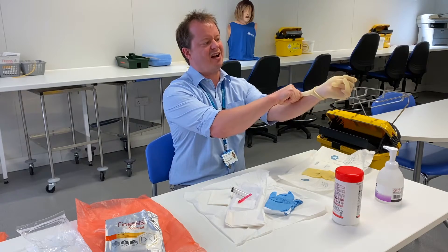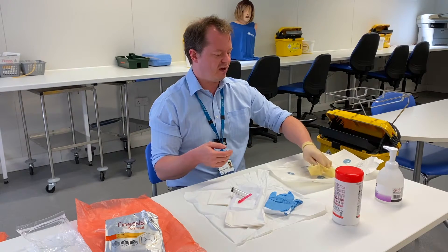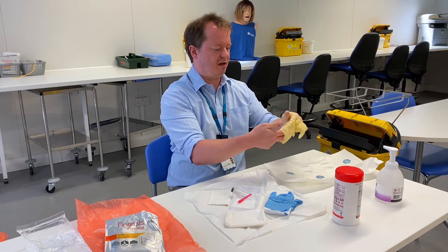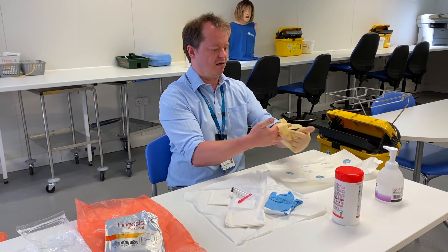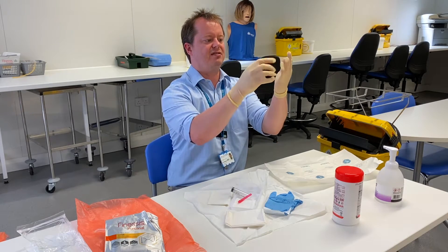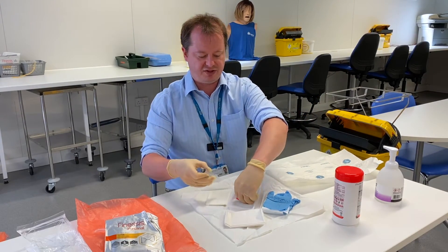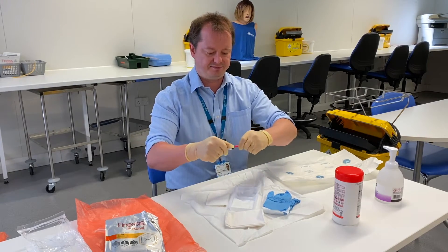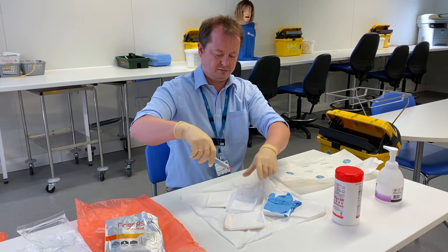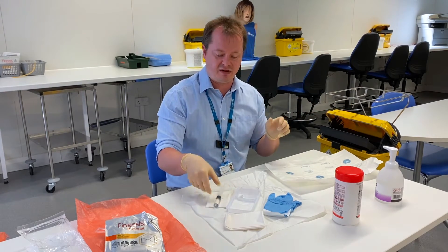Now if you get your finger stuck as you're putting on a pair of gloves, that can happen all the time — just don't panic, try and work with it, and then put your glove on your other hand like you would normally. Once that's on, you can use that gloved hand to sort out your other hand and make sure all your fingers go into the right places. Now I've got my gloves on, I can touch anything that's sterile, so I'm just going to draw up my flush as I would normally, and I can place it onto my field.